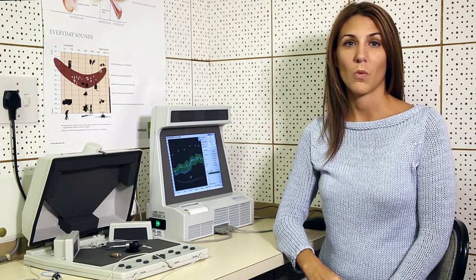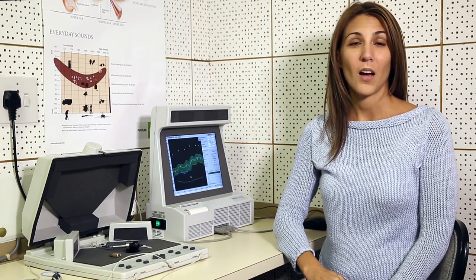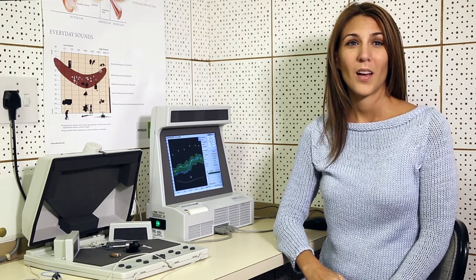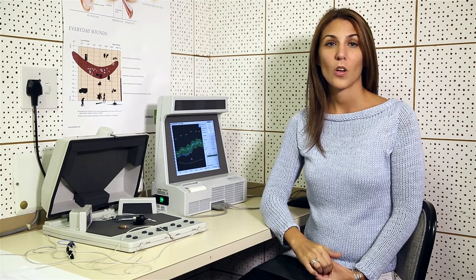So, you should now have a good understanding of what tests we are using and why, what the different parts of the equipment are used for, and how to select the necessary parameters that will be used to create a client-specific target for gain. In this video, I'm going to show you how to enter the necessary information and how to do all the necessary tests.